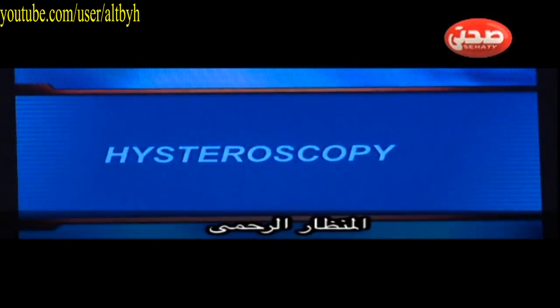For the hysteroscopy, you also have to be aware of the components of the hysteroscope. You have to have the endoscope. You have to have the sheaths, which allow the insertion of the endoscope in the cervical canal. Also, you have to have a cold light source, and also a distending media, which we'll explain in detail later on.